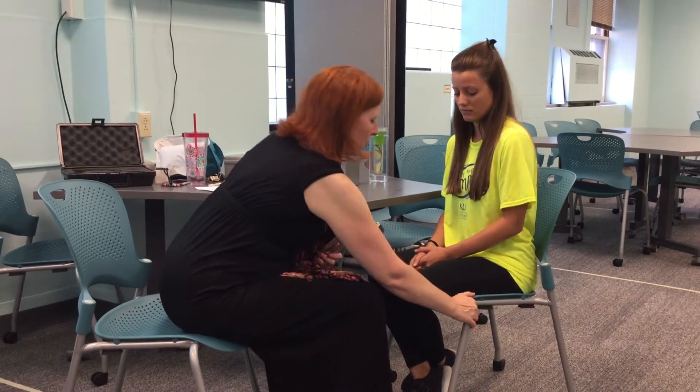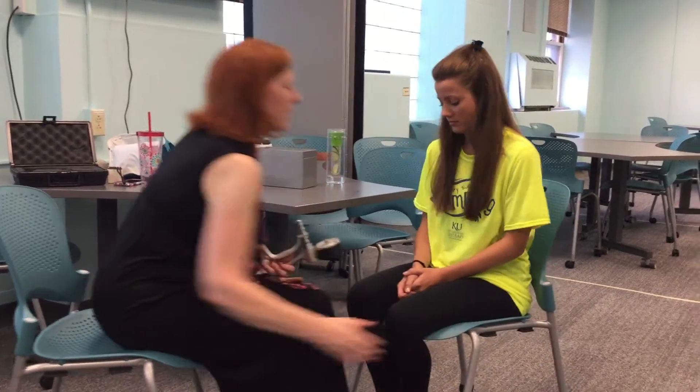So what we're going to do is test hand strength — we're going to test both hands. Always start with the dominant hand. Where this might be a factor is if you have had somebody who maybe has had a neurological event and is not able to use one hand; you wouldn't test that hand. So don't try to force it.